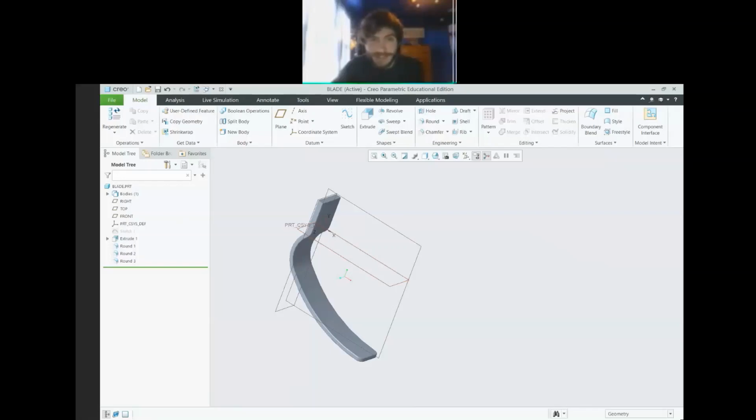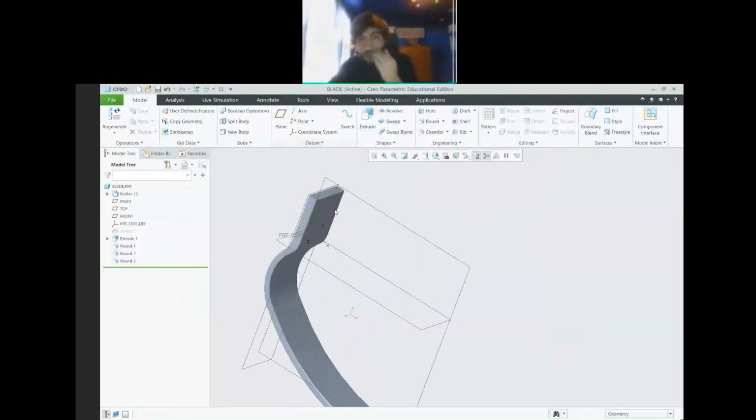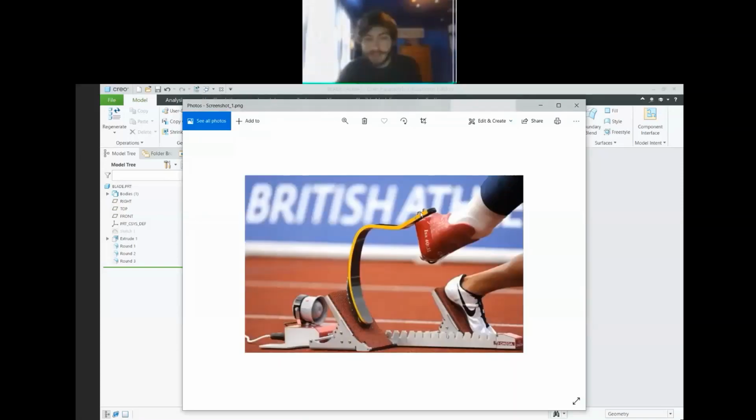All right, so the next thing, right, is clearly it needs some sort of way to attach, right? And so we're going to go ahead and create some holes on here, and we're going to do that with the hole tool. We could do it with an extrude, and we could cut it with some circles, and that would be fine. But because, as you see, we're putting bolts in there, we can use Creo's built-in information to know how big these holes need to be for certain size bolts. We could even, if we wanted to, make it a threaded hole through this, that it would have the right threads and it would make it the right diameter to actually produce the thing.